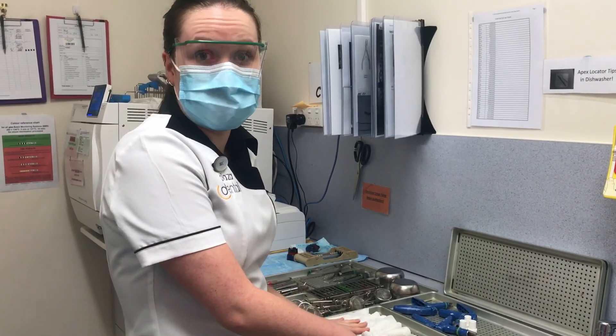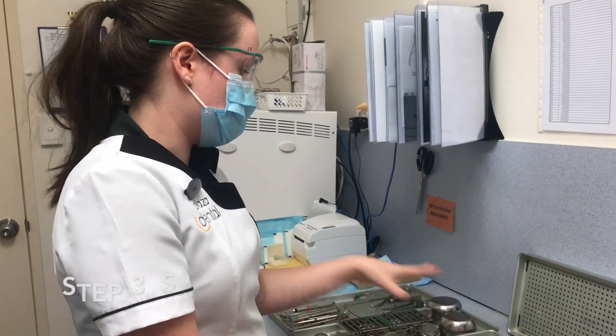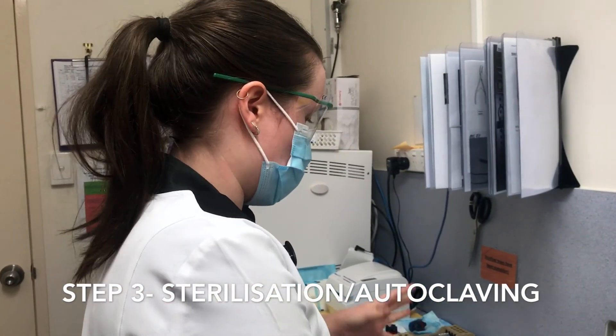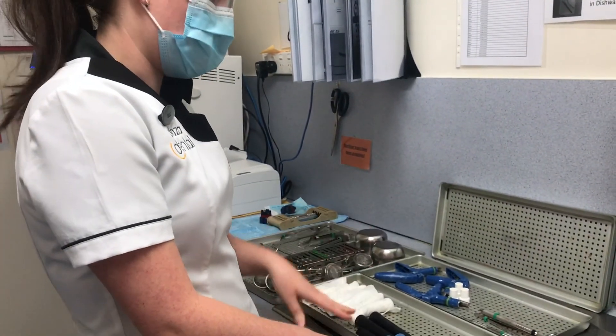Now that our instruments have been through the thermal disinfector, they are ready to go through the autoclave. I've lined them up on our trays. Again, you don't want too many instruments and you don't want them stacked on top of each other — they do need the space so they are able to be sterilized.